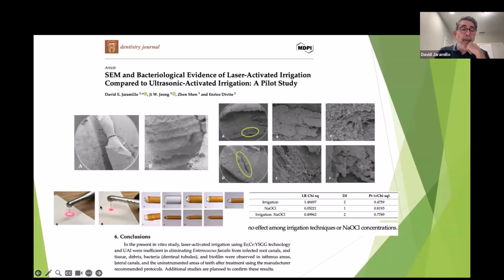And something we found very interesting was that when the laser tip is new, it has this tip here, like we can see here, and it produces this halo. Okay, and after use, we can see the degradation of the tip, as you can see here, only used for 1 minute, and the halo is gone.